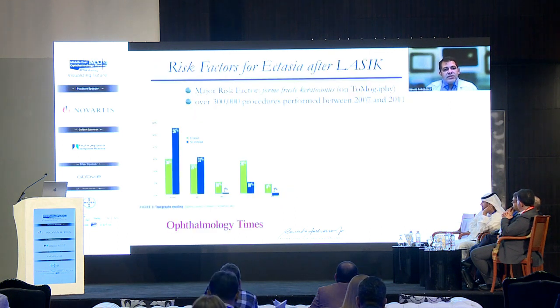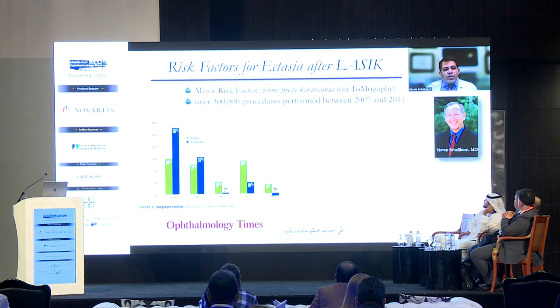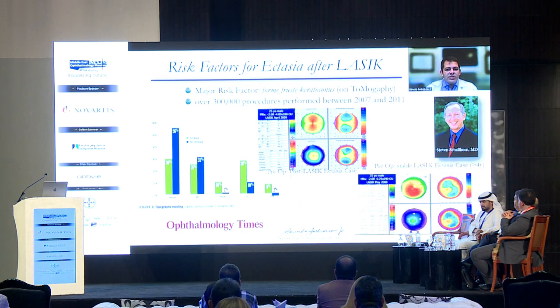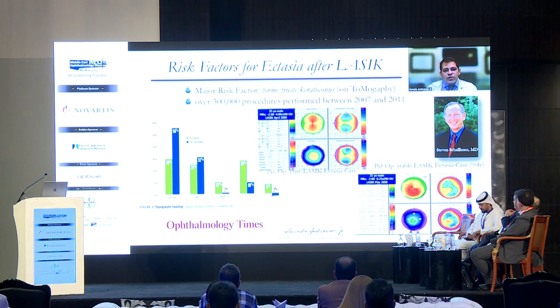Interestingly, in this nice series from Dr. Schallhorn, with over 300,000 LASIK procedures performed between 2007 and 2011, you have cases with normal pattern, even normal tomography, that had ectasia. The green is the ectasia cases: you have 30% of the ectasia cases with a normal pattern. Interestingly, there are patients with so-called forme fruste keratoconus with abnormal tomography. You see, this patient had a stable LASIK with more than 4 years of follow-up. So we need to go for enhancing sensitivity and specificity when we screen for laser vision correction.